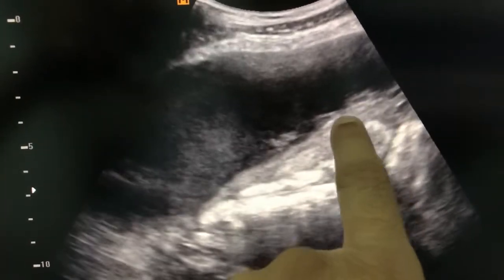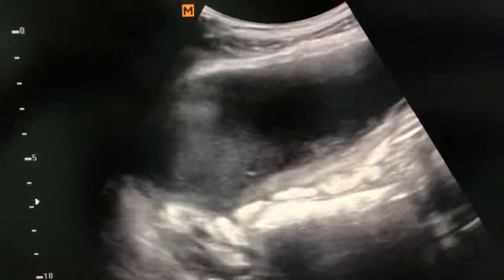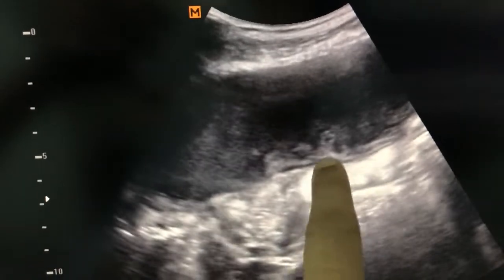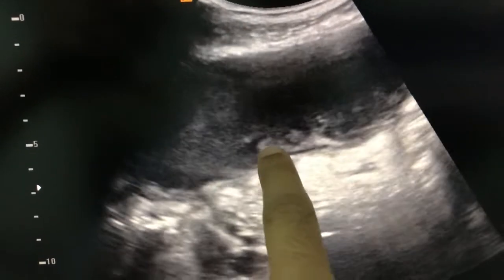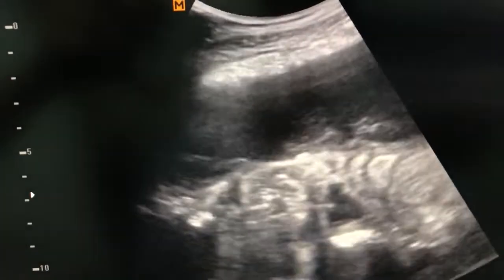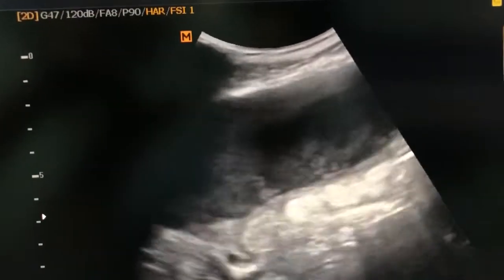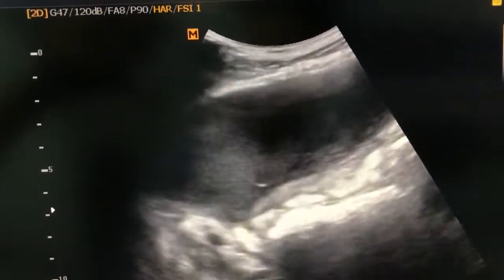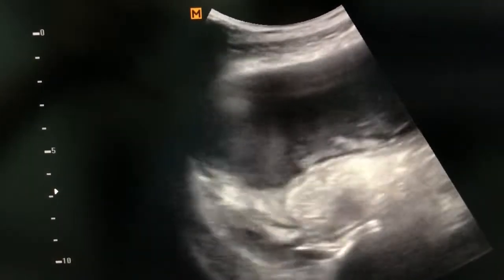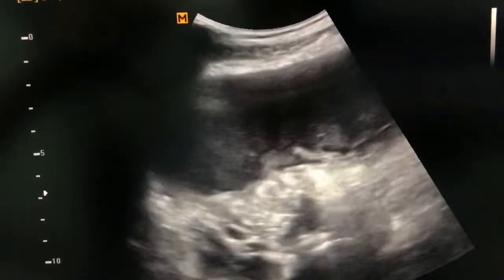and in this dependent part there are some hyperechoic areas, ill defined, and there are some projections in the wall of the cyst. So why is this kind of fluid there in the cyst, having a mixed echogenicity? This is due to the torsion of the cyst.